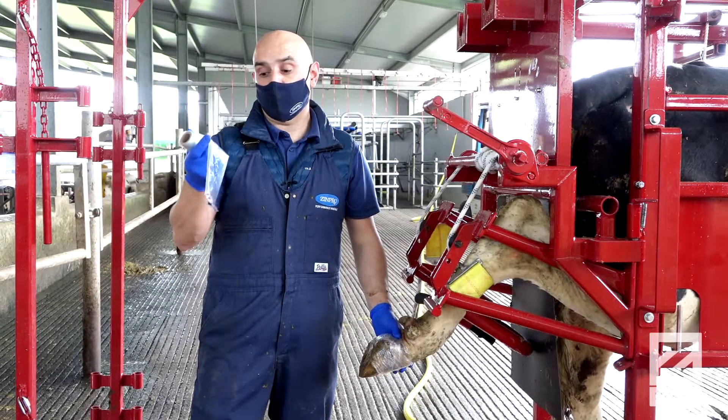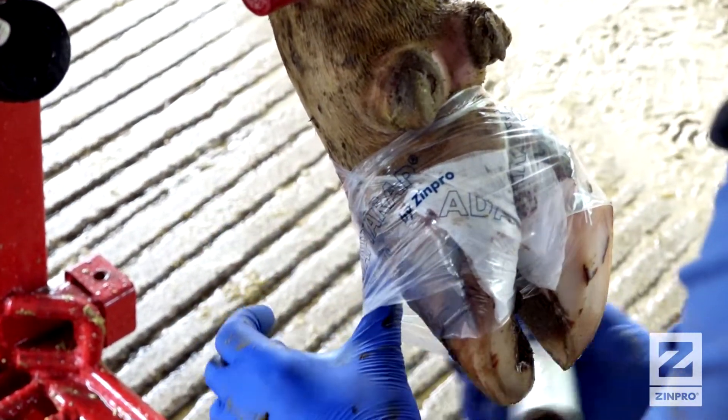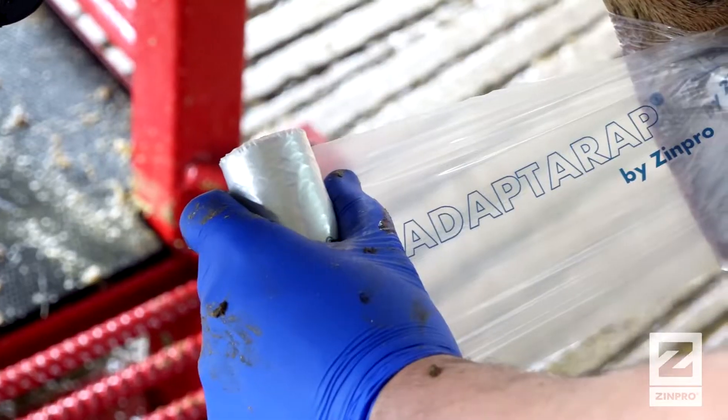Second, we have chosen a flexible but not elastic tissue, therefore the probability of creating pressure wounds is very low. And of course, the combination of compounds will not create any problem on farm equipment because the dissolution will be quick and complete.